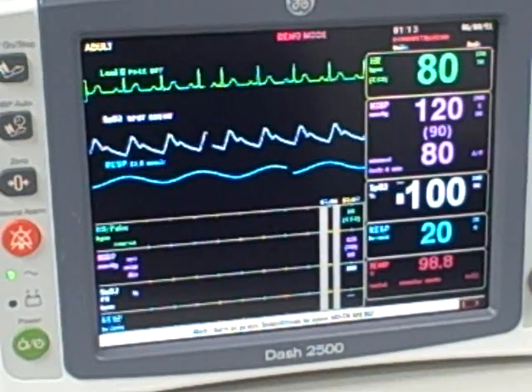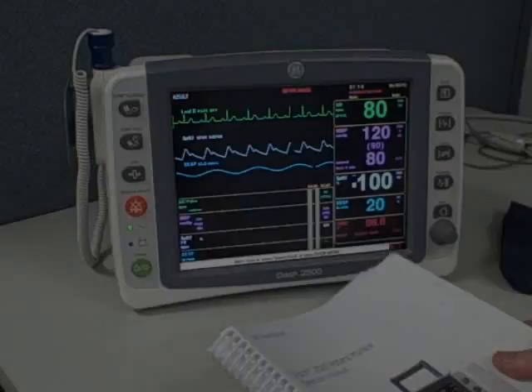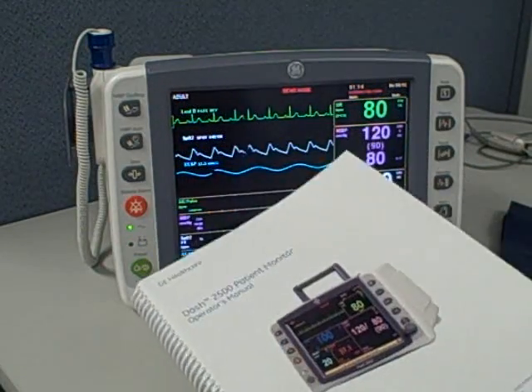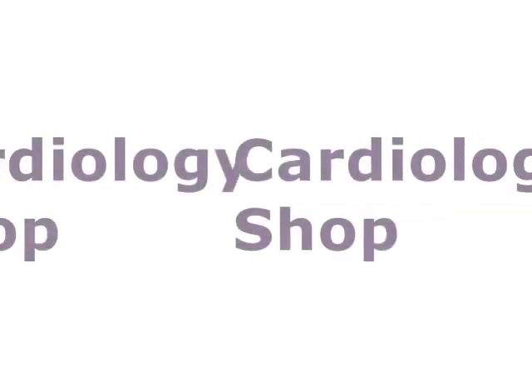Here's a close-up look at the 10-inch display. This unit comes with a two-year warranty, along with a nice comprehensive manual for the Dash 2500 covering all operational details.